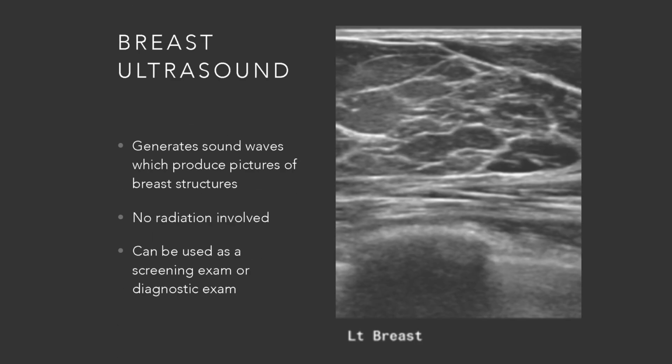Okay, so moving on to breast ultrasound. Ultrasound generates sound waves which can produce pictures of structures in the body, so in this case, the breast tissue. There's no radiation involved. We can use ultrasound as a screening exam or a diagnostic exam.